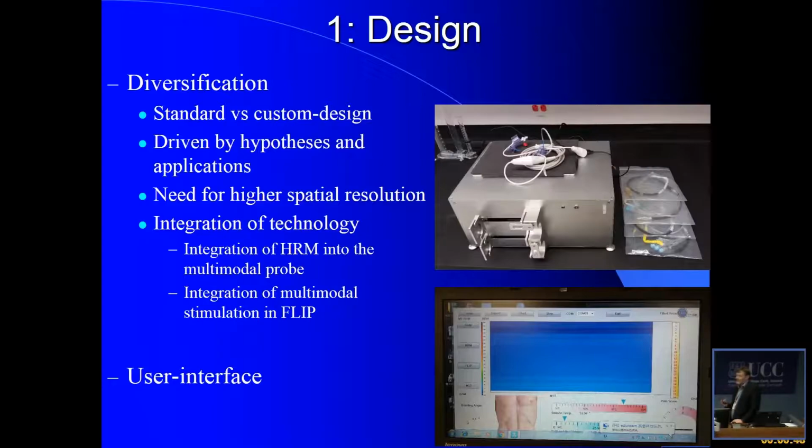I also think that there will be a need for higher spatial resolution, even though in the EndoFLIP now there's a very good resolution with 16 measurements. For some applications, we would need an even higher resolution. Just like with high resolution manometry, see how much we gain from going from 5-6 pressure measurements up to 20 or 24 or even more.